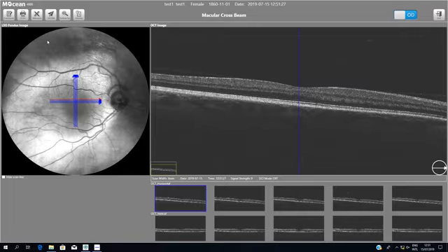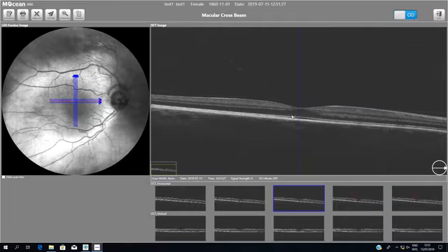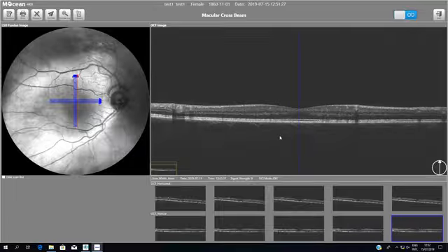In this screen, you see the SLO again, the raster high-definition lines the OCT has acquired, and of course, you can select the OCT horizontal lines, and by clicking on the image, you can always see here in this window all the information you need. Of course, you can move to the vertical lines, and once you click on an image, at the same time at the SLO image, you can see by red which exact scan is monitored, and you can watch it at the main window.